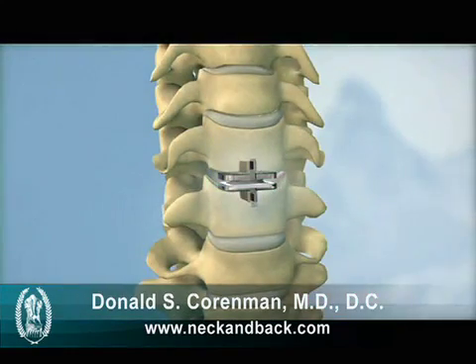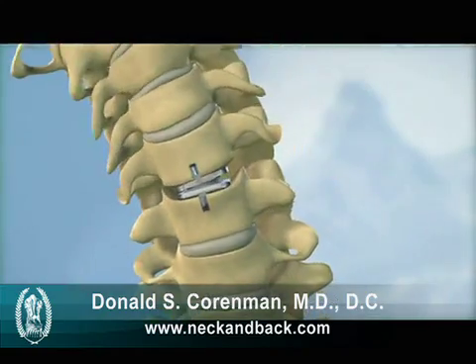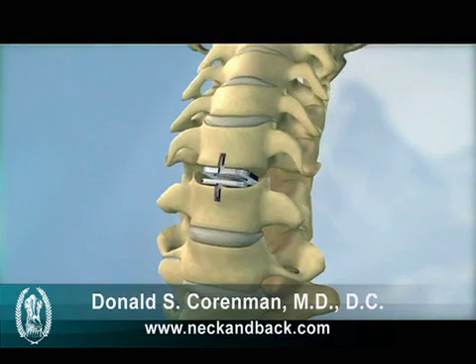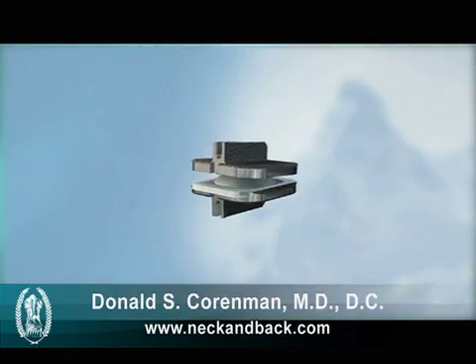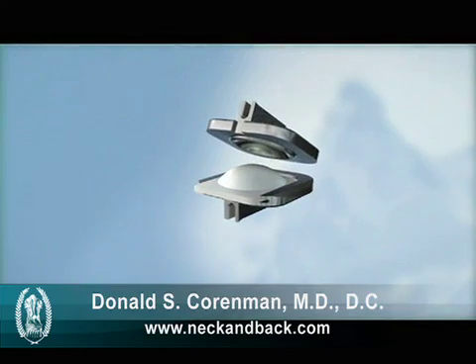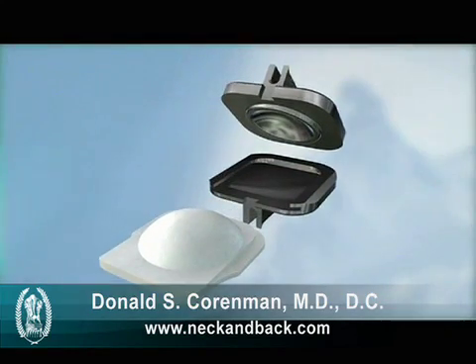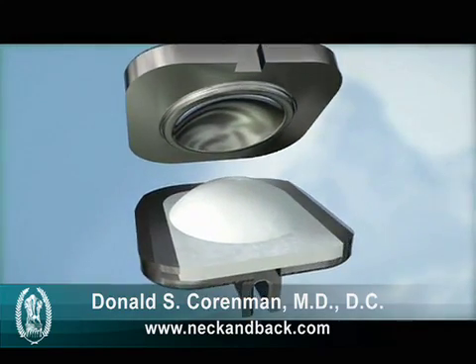The ProDiscC is a ball and socket implant composed of two cobalt chrome alloy endplates and a polyethylene insert. The polyethylene insert is affixed to the bottom endplate forming the ball, and a polished dome in the top endplate forms the socket. The implant components work together with the surrounding spinal structures to provide stability and function.